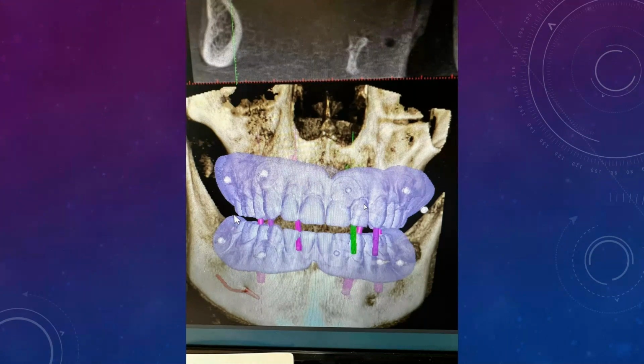I had some residents who thought that if they can just scan the denture 360 with their intraoral scanner, it'll work the same way to align things. Yes and no. Oftentimes, depending on what kind of sticker you use, the bead will be on the inside of the sticker, which will get registered really well with the CT scan because it works with contrast, right? But the intraoral scanner will just scan the top of that sticky portion, the top of that scotch tape, okay? And you don't have the actual outline of the marker. Aligning those two things together could be quite problematic.